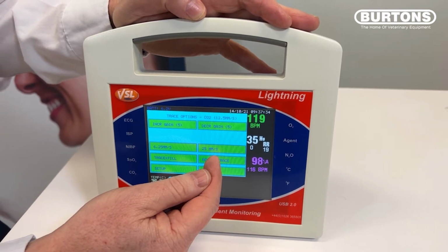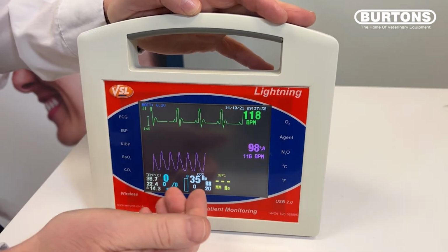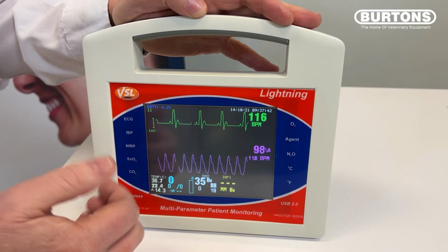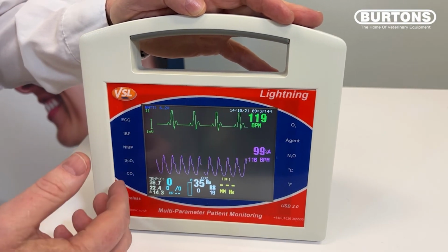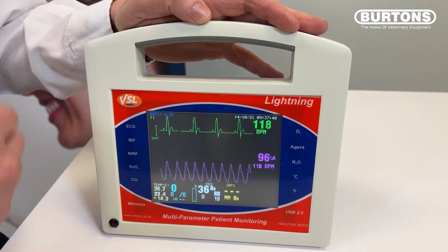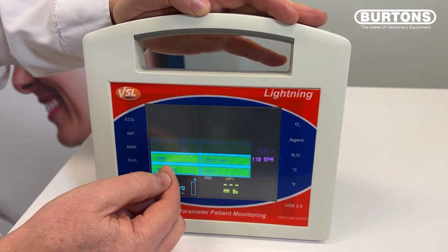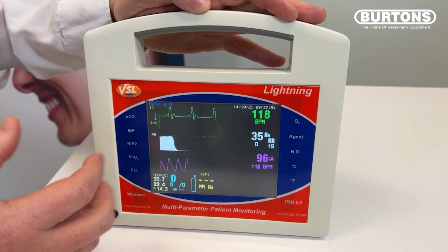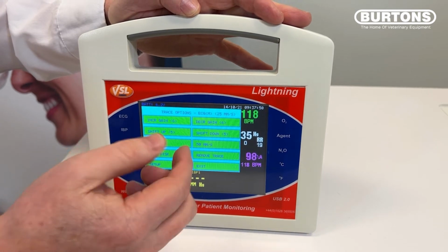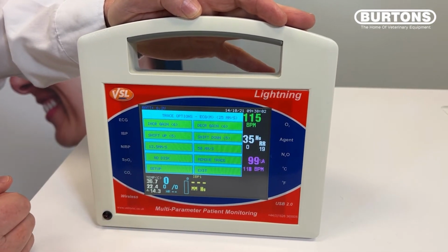And if I touch on remove trace, this has now taken the trace off the screen and placed the information purely in a numerical form at the bottom of the screen. So the information is still there, the monitoring is still going on, and the data is still being sent back to a PC if it's connected. And by the same token, if I touch that now, I can add the trace and we'll put it back on the screen. So the simple concept is, if you touch any trace, you have the option to alter the effects and the visibility of that trace.